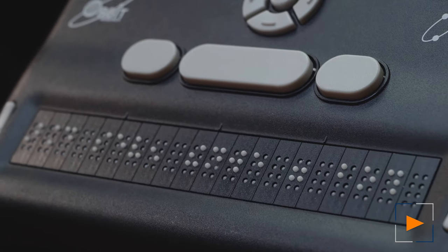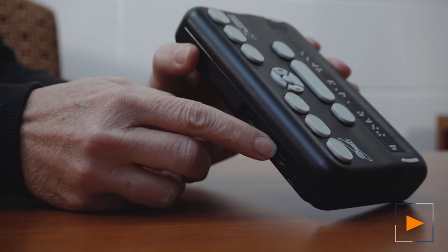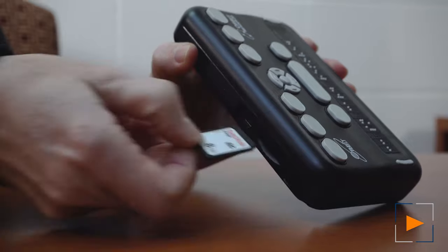When you switch to the standalone function, you don't need to be on the internet, but you do have to access files to teach and practice Braille reading and writing. The device is simple compared to other Braille displays, so the only option for storage is on the SD card via the slot in the back of the device.